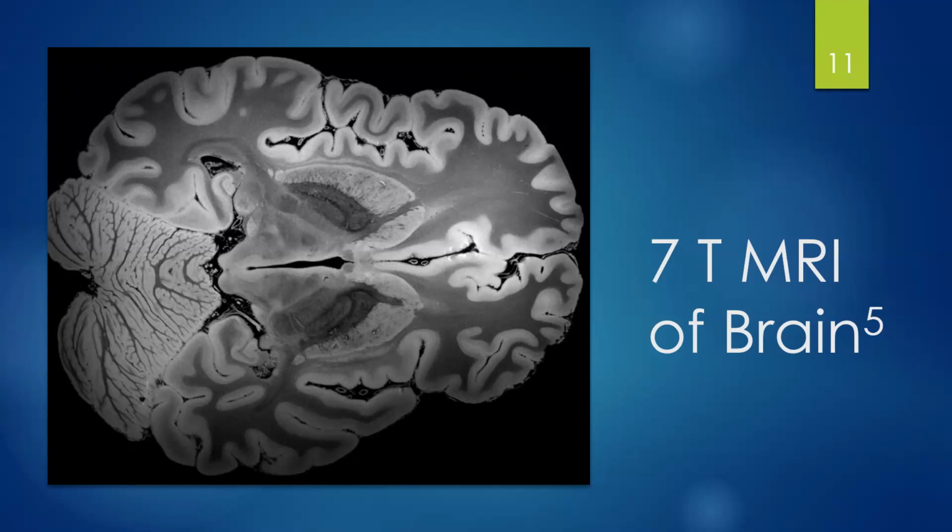But the detail that you're able to get down to, the fine structures that you would see through here, like the parts of the various fibers within the ventricles, very clear distinctions in the gray matter versus the white matter, into the various structures of the cerebellum. So this very fine detail. And these images particularly are out of Boston. Very beautiful stuff, and I'm going to follow this up here with a quick video of the slices. They animated some slices of an MRI sequence from the 7T scan of the brain.